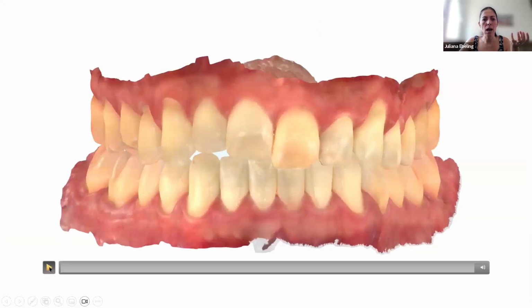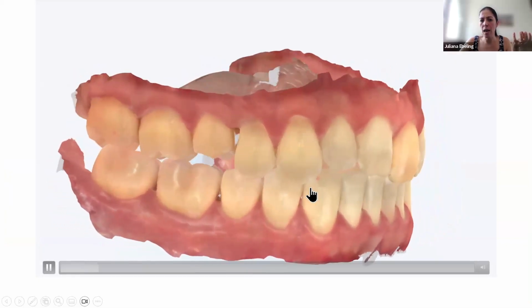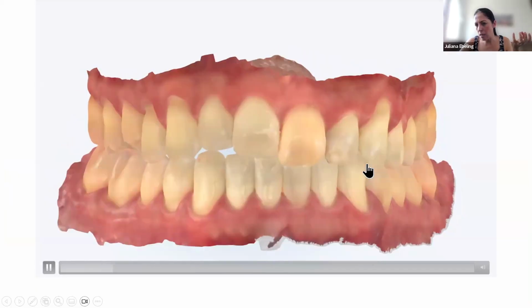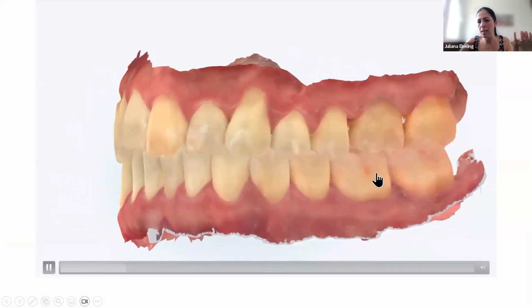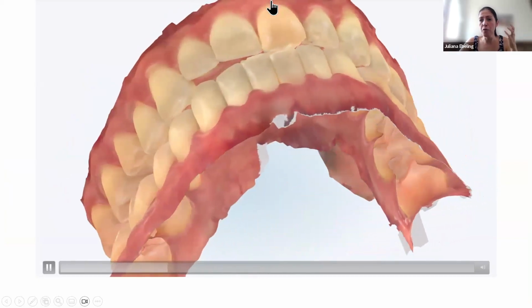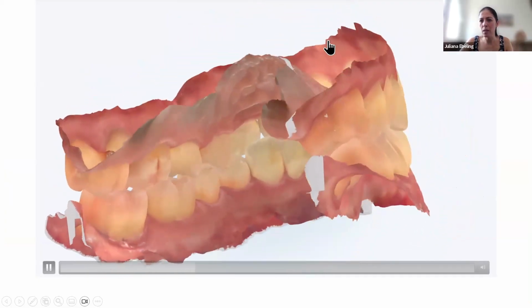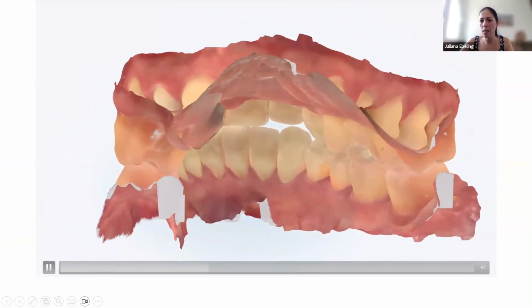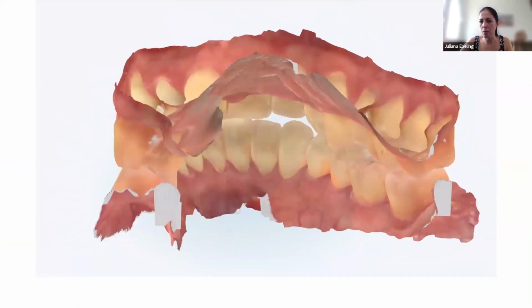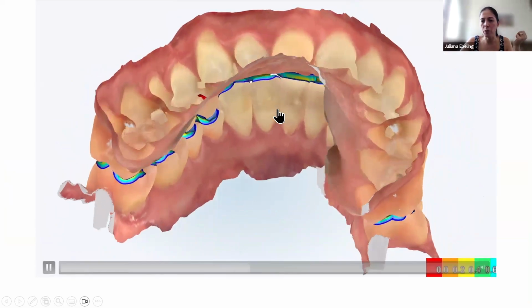So this is how the patient finished the orthodontic treatment. Look, we have less space between canines, better curves, but some teeth we could not move because of this ankylosis. And this incisor has a very compromised structure because of endodontic treatment.